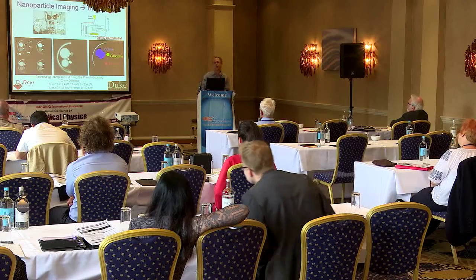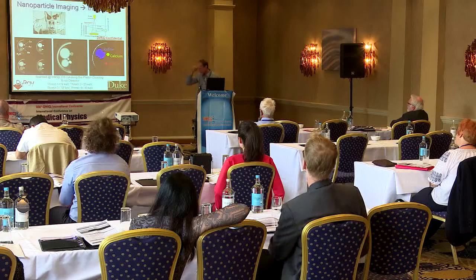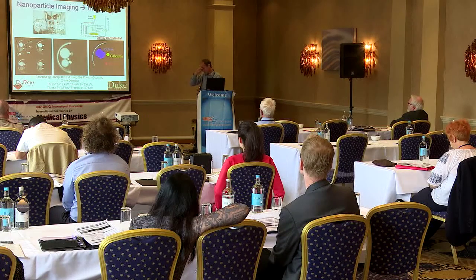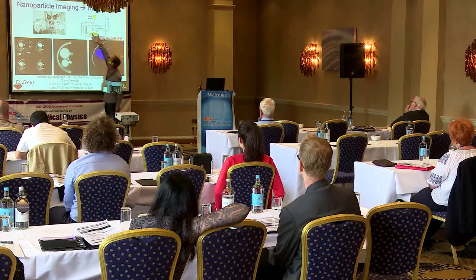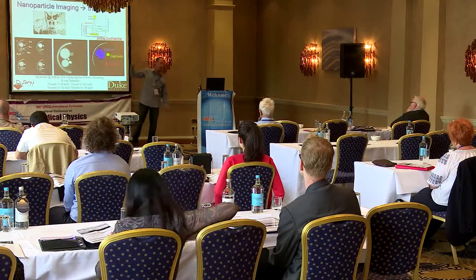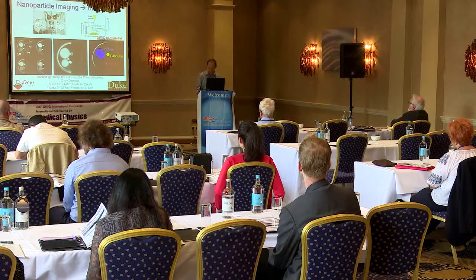So this was done in a preclinical system, and we've done some imaging in a murine model, or a mouse model, to go beyond phantom imaging, and it's done in an orthogonal system using a conventional energy integrating detector to demonstrate that we're not losing any of the other performance quality factors by moving to this new method.